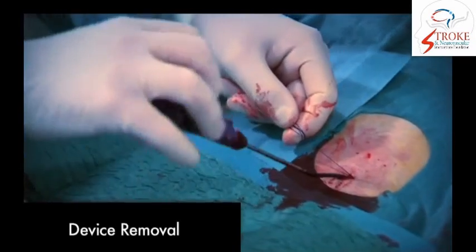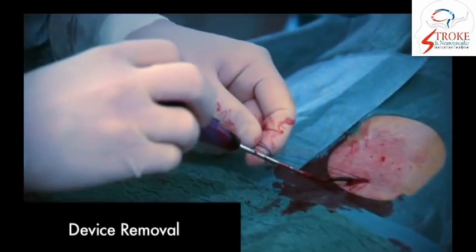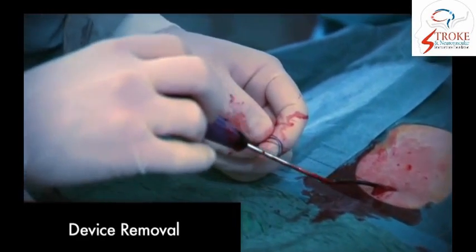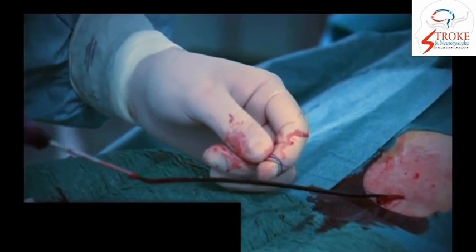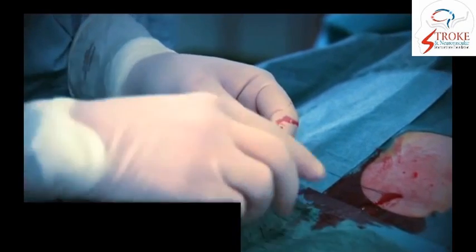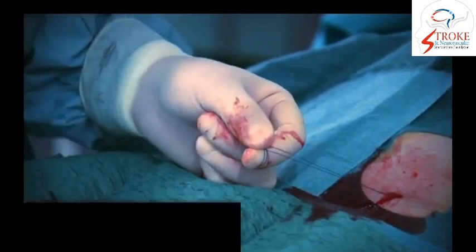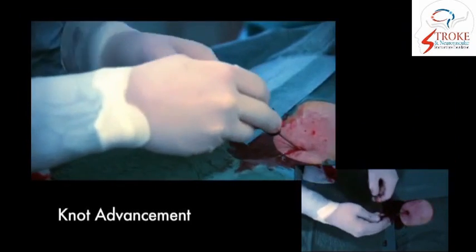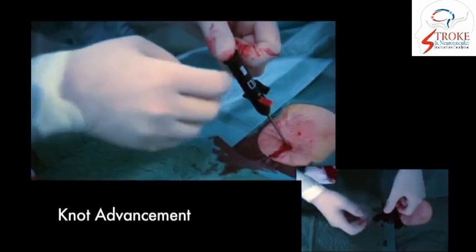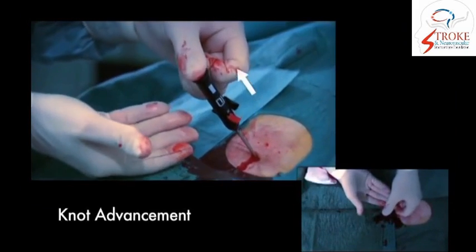Then very carefully the suture is kept taut while the device is withdrawn so as to form and advance the knot. Then using the knot pusher, the knot is being pushed against the artery.